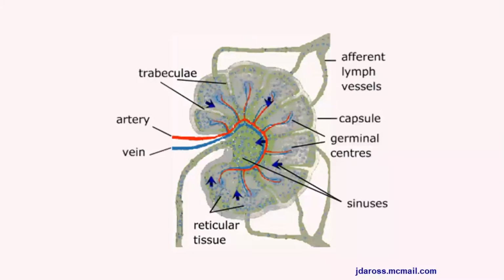Just to understand the lymph node in the lymph tract, here you have a chance to reveal the anatomy and physiology of the lymph nodes. Take a look at this cortex and hilum. The only place where we have blood flow is in the hilum region, the central part of the lymph node. Note that in the cortex, there is no blood vessel. When you map with color Doppler, it's important to keep this physiology in mind. And the other part is the lymph tracking. Also, the lymph arrives through the different parts of the superficial part of the lymph node.